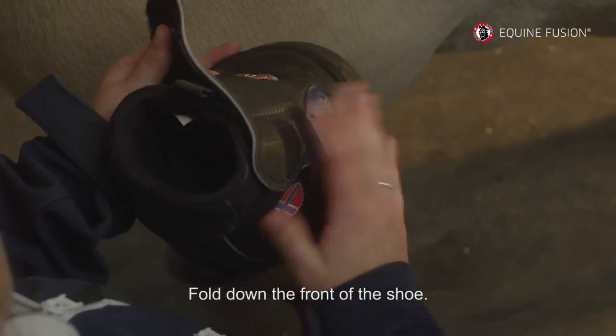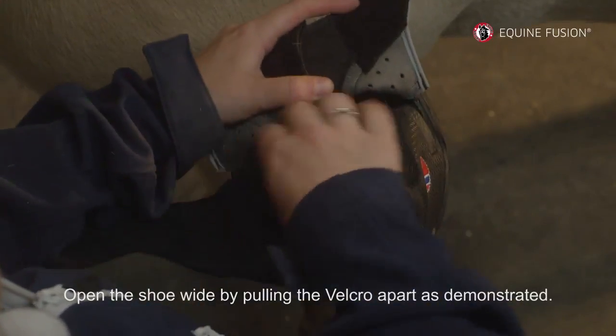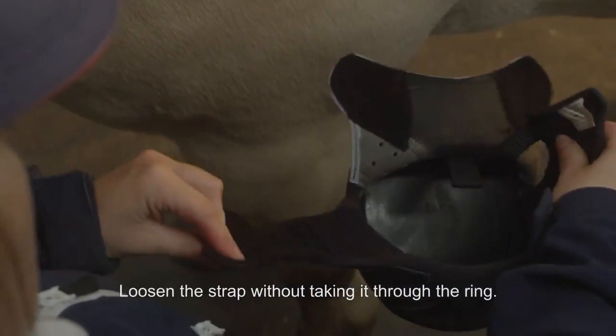Fold down the front of the shoe. Open the shoe wide by pulling the velcro apart as demonstrated. Loosen the strap without taking it through the ring.